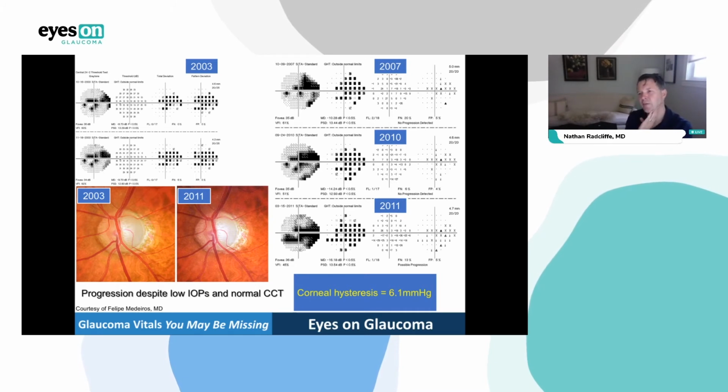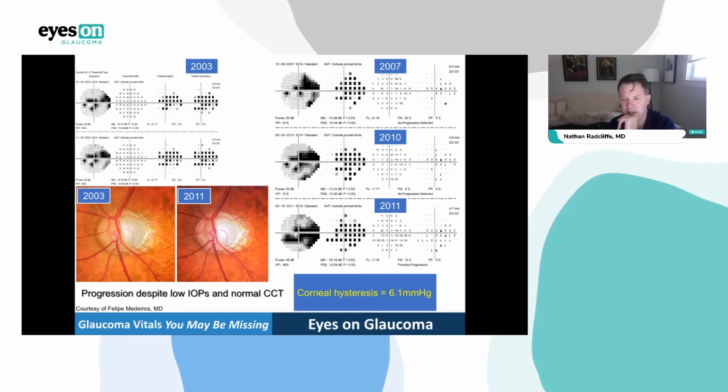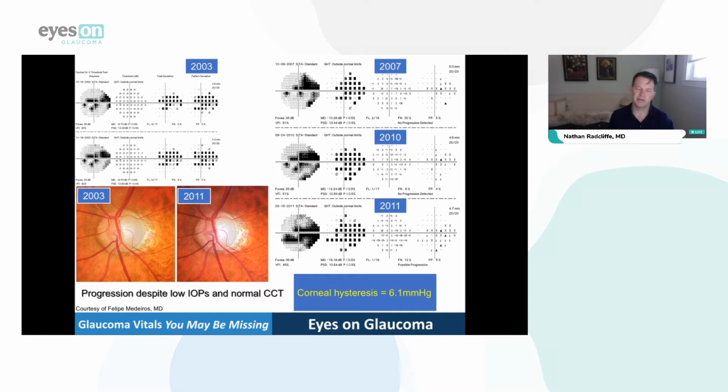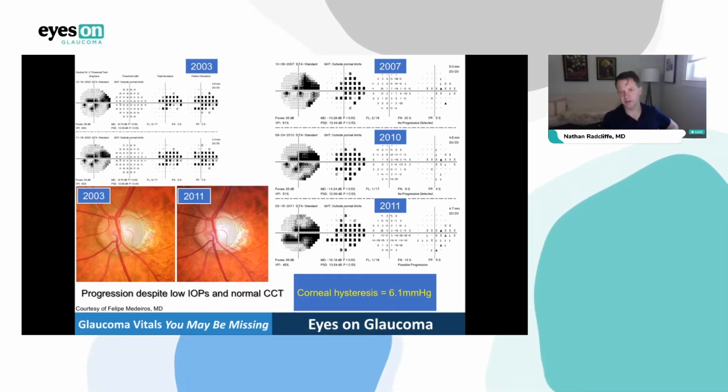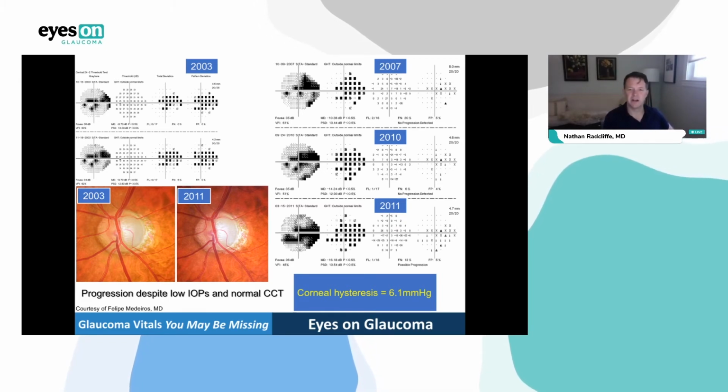So, I think that if Justin Schweitzer were here, he'd probably say that just as often hysteresis helps him increase testing frequency, take another look at things, repeat an OCT, repeat a field, kind of management things as much as treatment, because I'm not going to get a hysteresis of 6.1 and schedule a trabeculectomy the next day. But I might start to put myself in a position where, if things play out the way I suspect they will based on hysteresis, I will have all the clinical evidence I need to do surgery going forward.